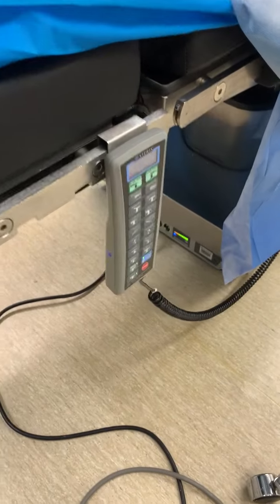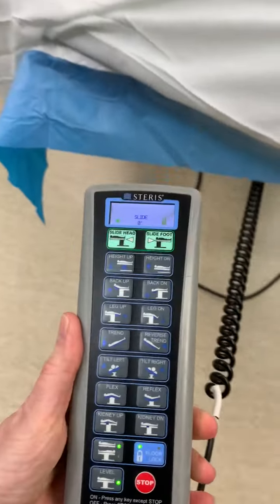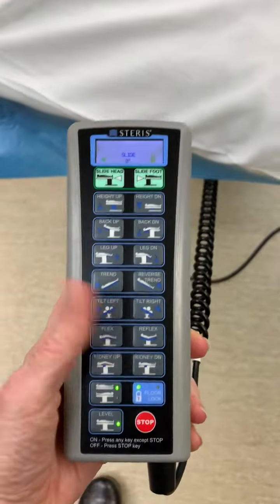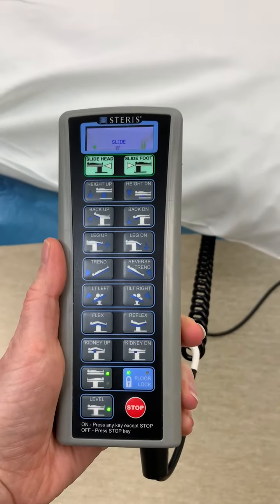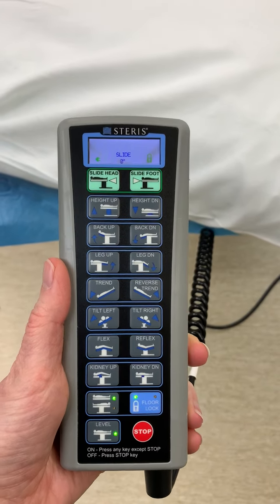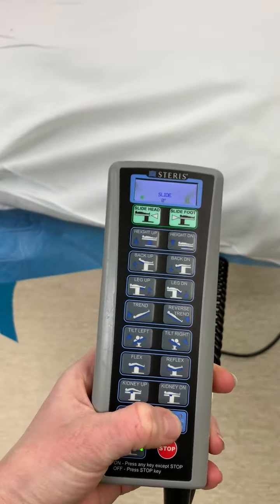Up here by the head of the bed is the remote, if anesthesia isn't available to grab it for you. If we want to get this bed out of here because we have an emergency c-section that possibly is going to have the operation done in their actual labor bed and we want to get this out of the way, you would press and hold this button for three seconds.